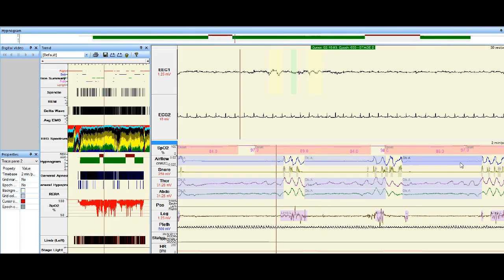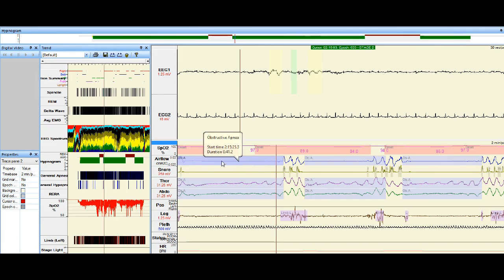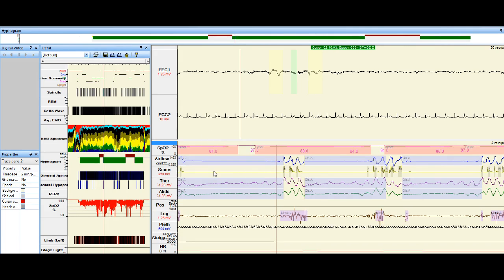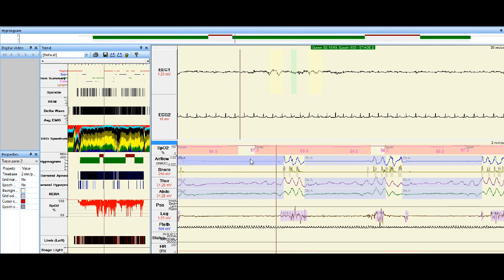As you can see in this scenario, you can see there's long periods here. This one's 41 seconds where there's no flow coming through. It should look like this right through. See how it's in, out, in, out, in, out. That should continue right along.